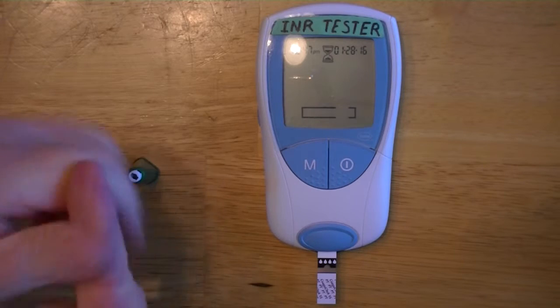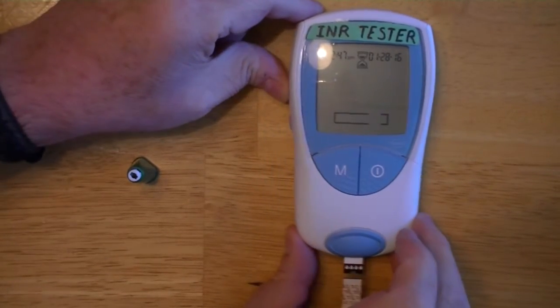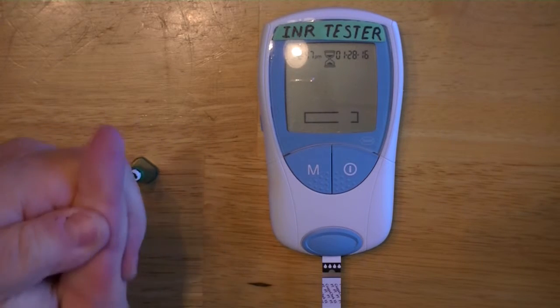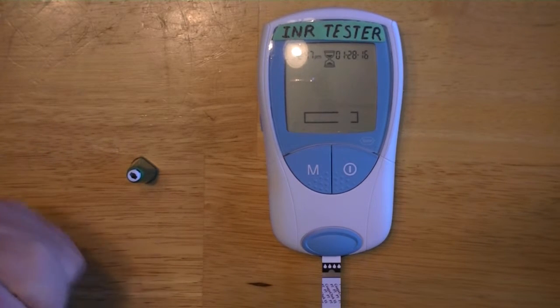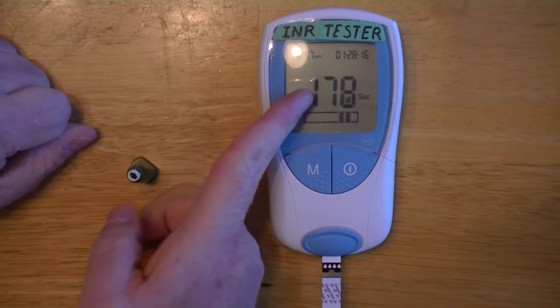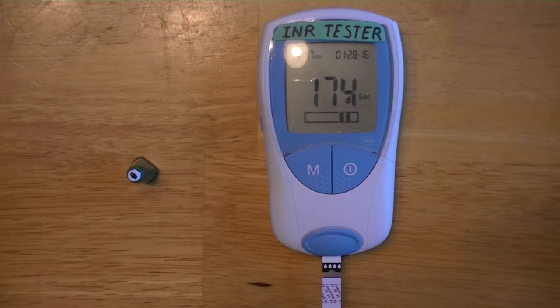When it gives you the countdown signal, it will count down roughly three minutes, so you have plenty of time to apply your sample. The machine seems to be taking a long time today — there we go. Notice we have a countdown starting with a little blood droplet telling me to apply blood.